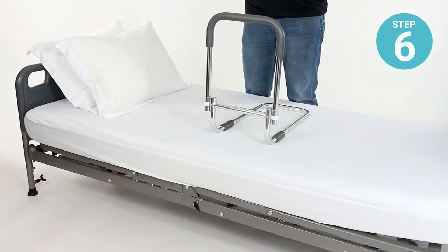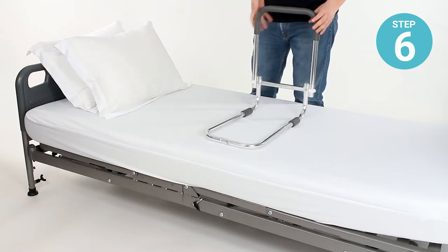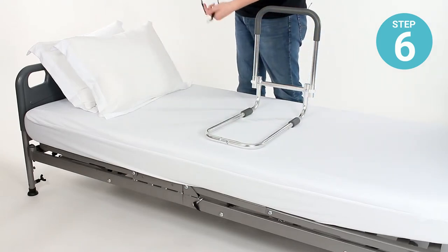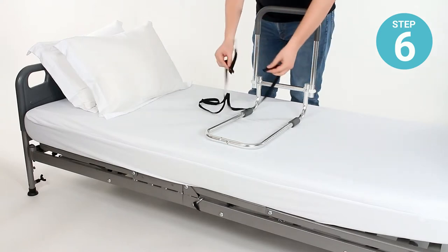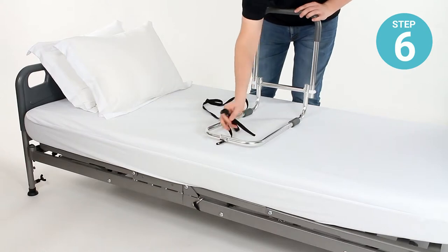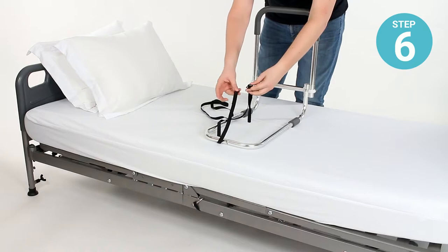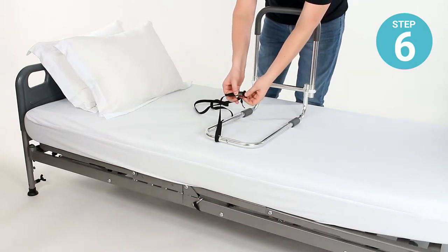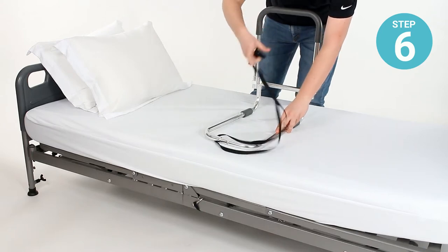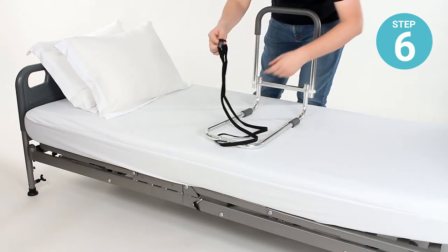Step six: now that the rail is assembled, we'll cover installation. Turn the rail around so that you can see the frame strap. Wrap the end of the frame strap around the base rail at the very end, fasten the buckle together, and pull the strap tight so that the end of the strap furthest away from the rail is the buckle.